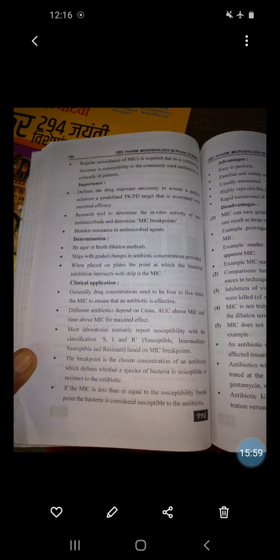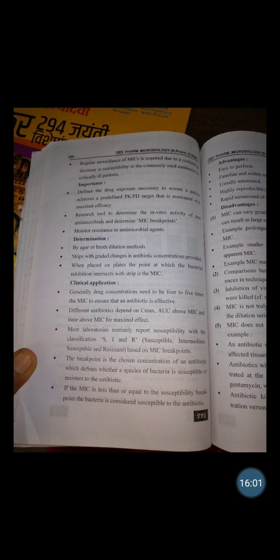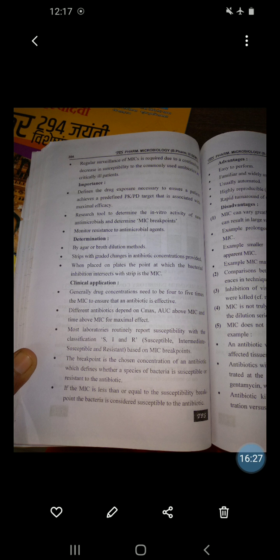Then the breakpoint is the chosen concentration of antibiotic which defines whether the species of bacteria is susceptible or resistant to the antibiotic. If the MIC is less than or equal to the susceptibility breakpoint, the bacteria is considered susceptible to the antibiotic.